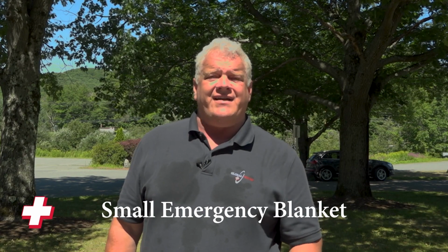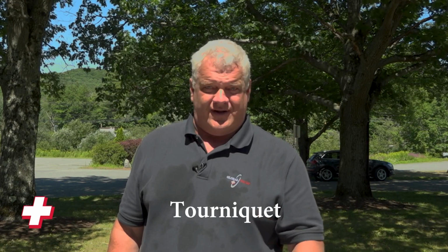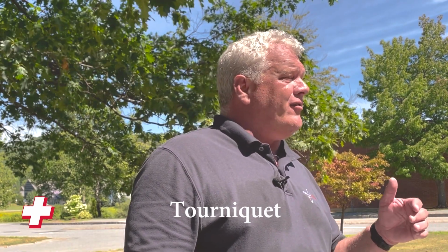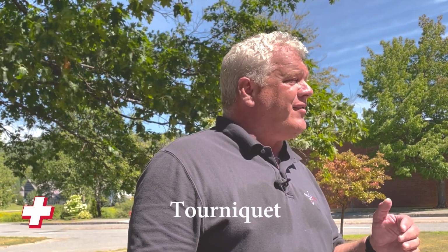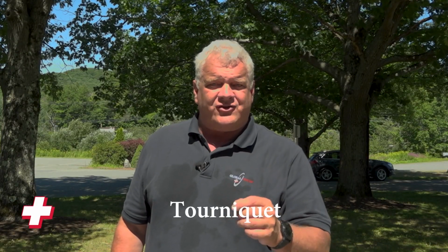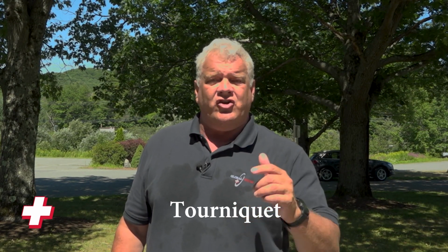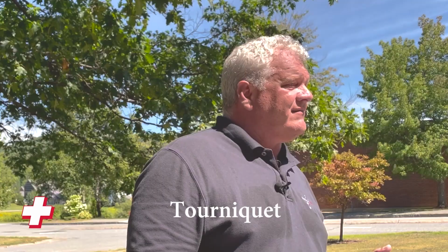One of the most life-saving items that as a first aid provider you may use in a first aid situation is a tourniquet. A tourniquet will restrict arteries and stop an arterial bleed. Arterial bleeds are life-threatening, and they are very likely life-threatening in the time before emergency providers arrive. Important things about a tourniquet is where you have it. You're going to need it so fast, you're going to recognize that arterial bleed, you need to get a tourniquet on. You don't want to have that tourniquet in your first aid kit buried in the bottom of your rucksack.